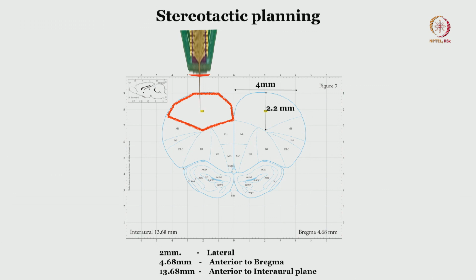Apart from that, you need to be ready with the stereotactic coordinates of the structure that you are going to target.